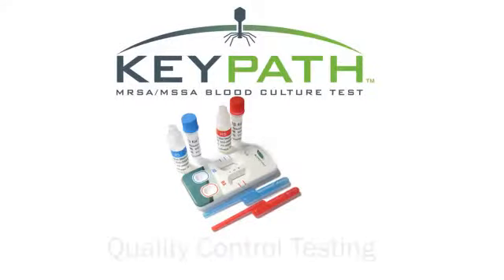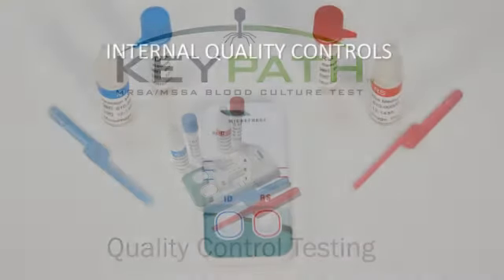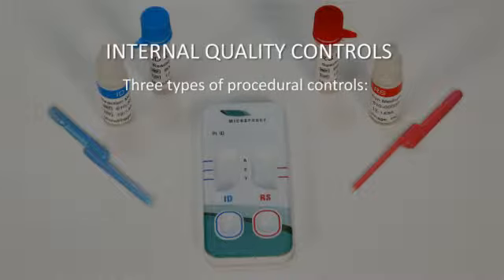In this portion of the training video, we will review internal quality controls and procedures for performing external control sample testing with the KeyPath MRSA/MSSA blood culture test. Internal quality controls. Each KeyPath test includes 3 types of procedural controls.